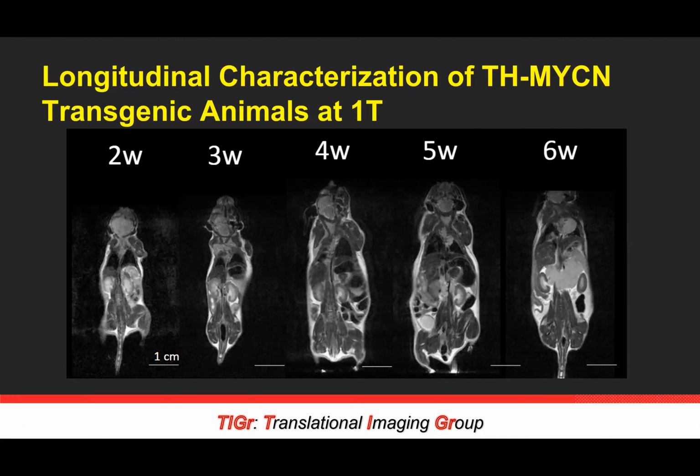This is really interesting data for us, and it's really important to note that it's very valuable to use these permanent magnets, as we have relatively high throughput for single animal imaging, and we're able to look at dozens of animals per day and be able to just characterize this longitudinal progression throughout the tumor development, which is very critical for being able to not just get volume estimates, but also look at vasculature progression and maybe other secondary findings, which you may not be able to get using calipers or other external measurements.